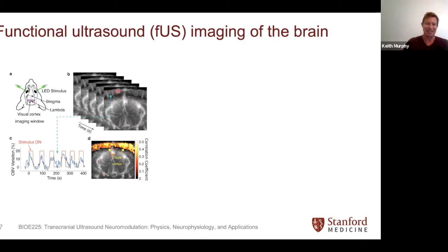So this is all cortex here. Actually, the cortex here wraps around. So this is all cortex here, and this is subcortical down here. We are at Bregma minus 7. I'm sufficiently satisfied. We can move on now. Okay.